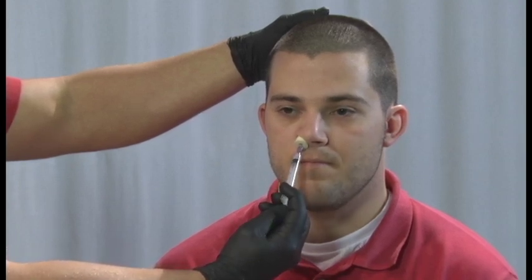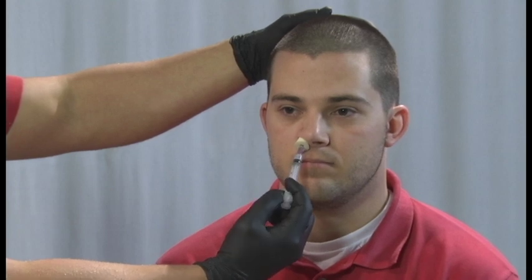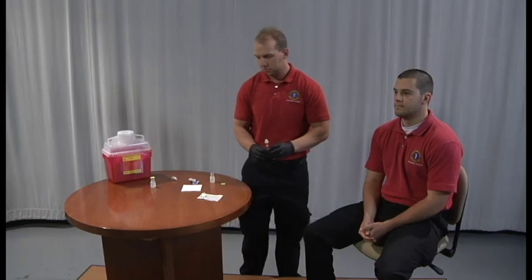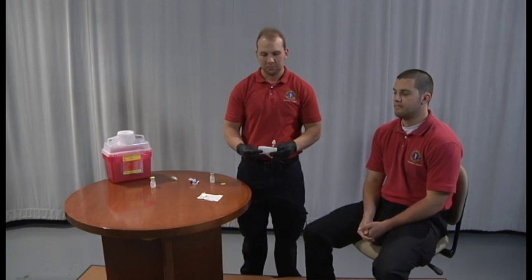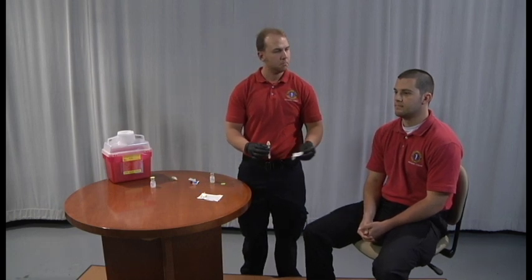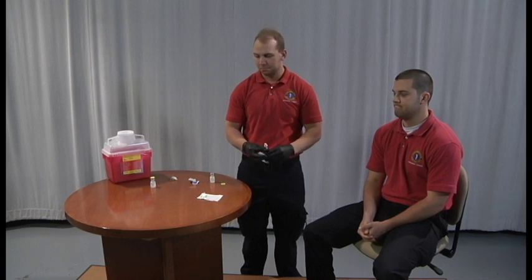Briskly depress the syringe plunger and instill the medication. Be sure to instill no more than 1 milliliter per nare. Administer the remaining volume into the opposite nare if needed.